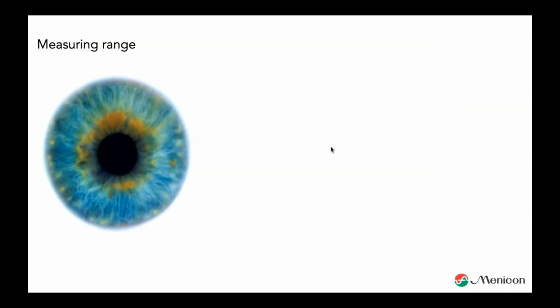Beside that, let's look at two different topographers and the measuring range. The size of the area of the cornea that is measured depends on the topographer. Let's assume that we start fitting in the periphery, or let's say we start fitting ortho-K, and we fit ortho-K lenses quite large on the cornea, around 90% of the cornea. It covers 90% of the cornea.